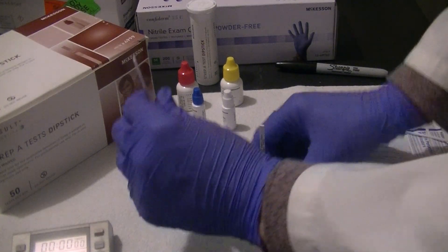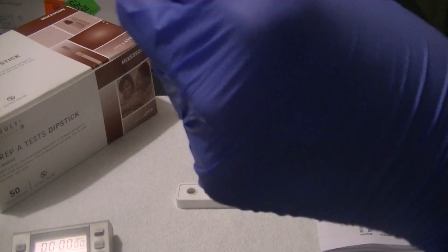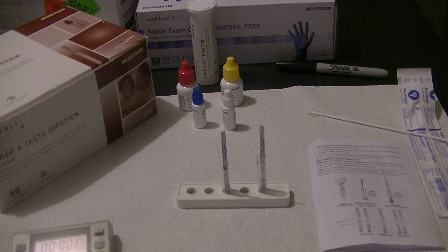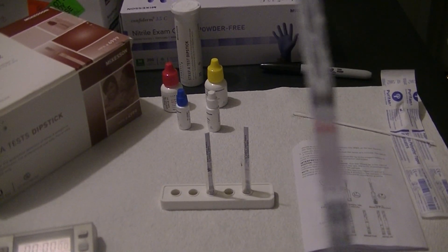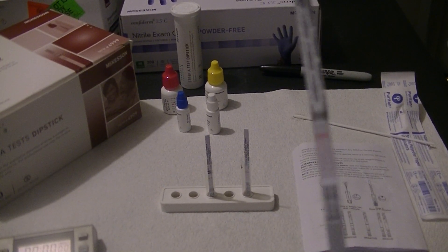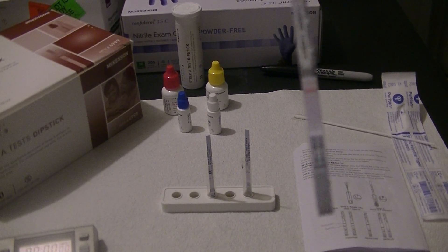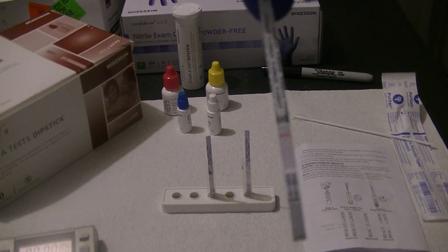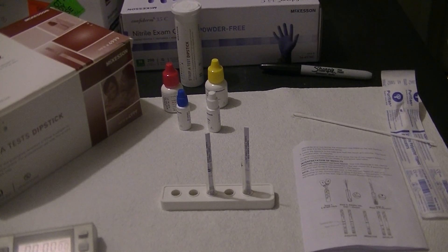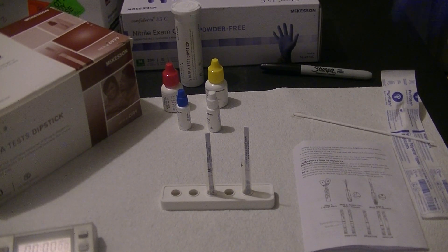After the five minutes, you can pull the strip out of the test. And for the positive control, you can see a control line, but you also see a faint positive test line. It is very faint, but it is there. So the positive control was positive.